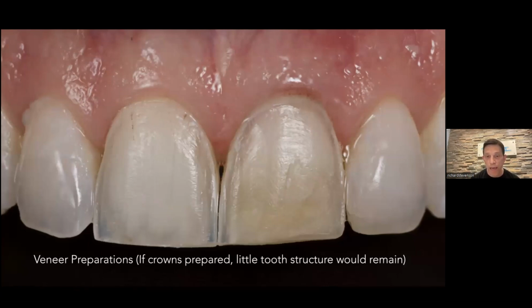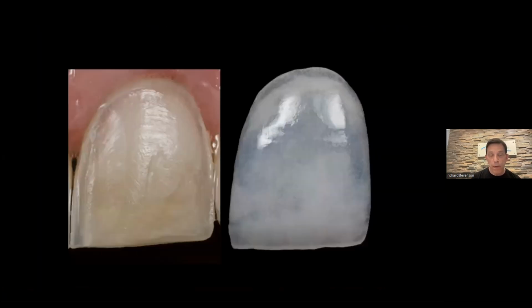They look okay. I mean, they have good readable margins. They're in the right place and everything else. But the reason why I focus so much on preparing these carefully is because the size of the endodontic access on the lingual was huge, and I didn't want to perforate the enamel. That actually can happen.